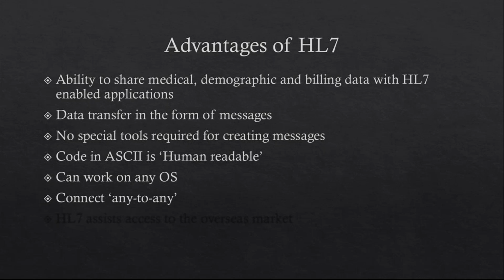As we have seen, when we talk about integrating two different applications, they do not need to understand the architecture of the other's database. They just need to generate HL7 messages and send them over, and the other party who is receiving should be able to interpret HL7 and insert the data into the database. So there is not much learning needed about other systems, which enables connecting any system to any system.